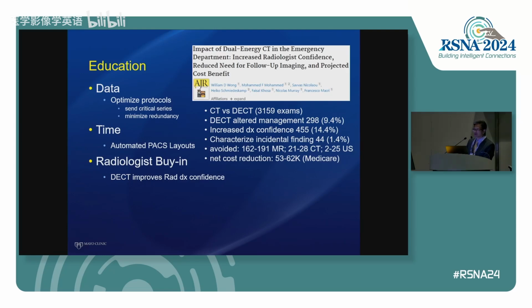Interestingly, the net overall cost reduction when they implemented this was over $60,000 in Medicare dollars. The telling part of this study was that the co-authors had a practice change in their group. They now do all their ED exams using dual energy CT.